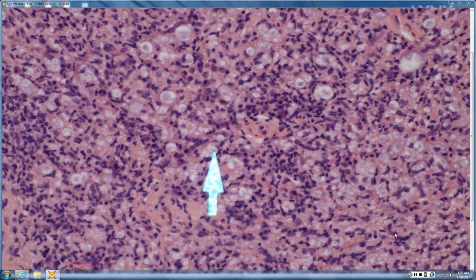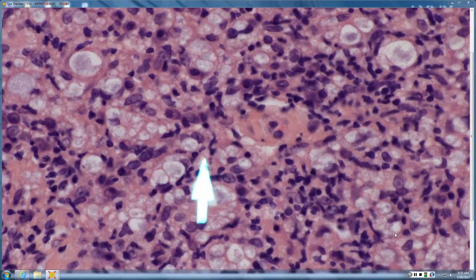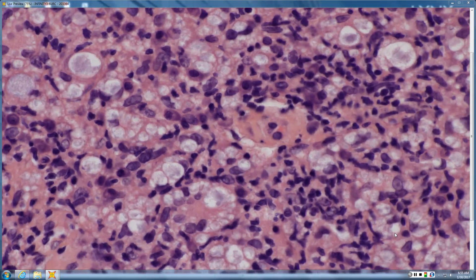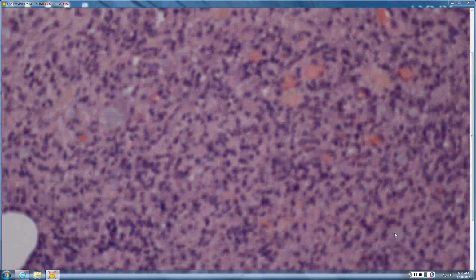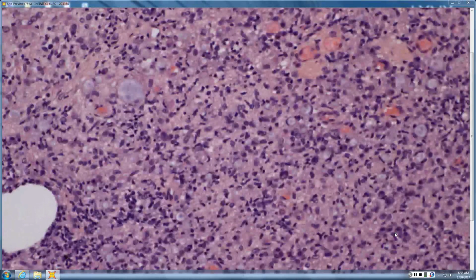And so if you do a stain, like a Fite stain, all these would turn brightly red. You can see here, there's just that sort of granular material. All that is organisms. Now, lepromatous leprosy is the multibacillary form, and so you do see lots and lots of organisms. But in the more tuberculoid form, you really find hardly any organisms, and then there's a lot of stuff in between. So here as well, in this other cut, there's lots and lots of organisms.